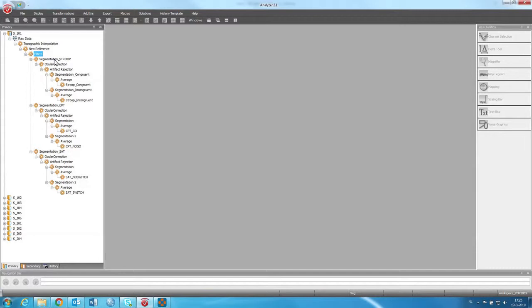Next on the list is segmentation, then ocular correction, artifact rejection, and then we average the data.